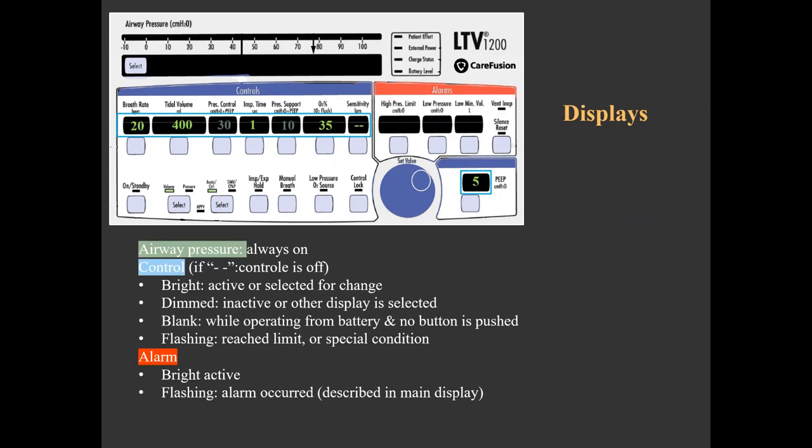Note that some displays can show dashes, indicating that the control is available but turned off — for example, dashes in the rate when the modality is CPAP, or dashes in the sensitivity when the mode is controlled rather than assist control. The alarm displays are usually solid bright, indicating the alarm limit set. If an alarm occurs, the related alarm display will start flashing simultaneously with an audible alarm and an alarm message in the main display.